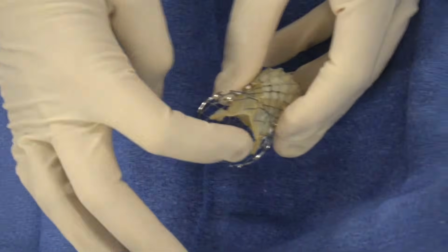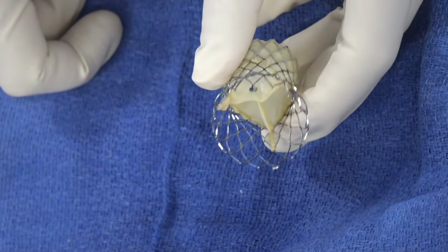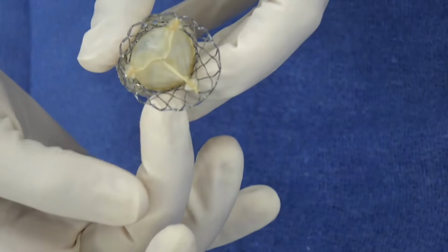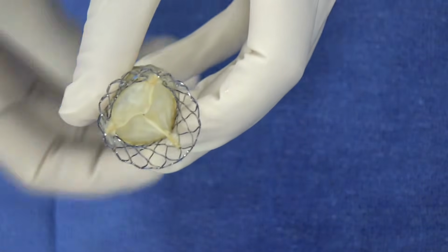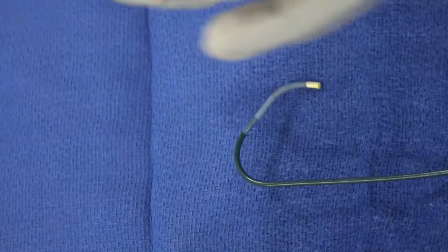So there are 3 posts where the valve is attached. When we are placing the valve, we are very careful to make sure there is commissural alignment, so that if you think left main is coming out this way, the post is not in front of the left main. The diamonds that are in front of the left main, we can access later on. So there's what's called a C-tab, away from the left main. So if you see these diamonds, the question was, will they be distorted?